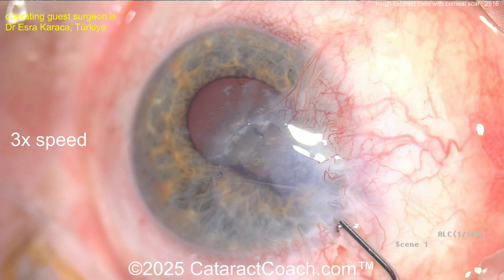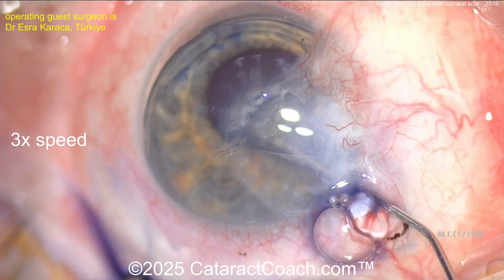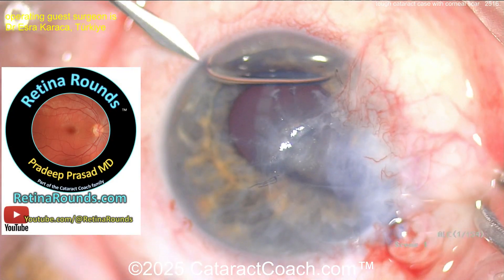I would sit temporally to do this surgery, away from this area. The surgeon made a paracentesis there, putting in a little trypan blue dye, which can be helpful to visualize in a case like this.